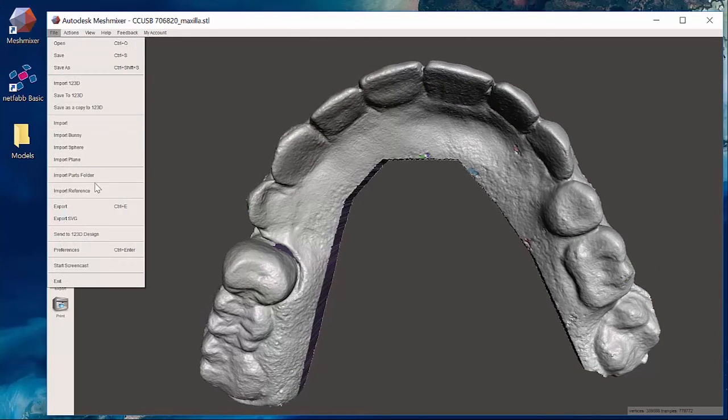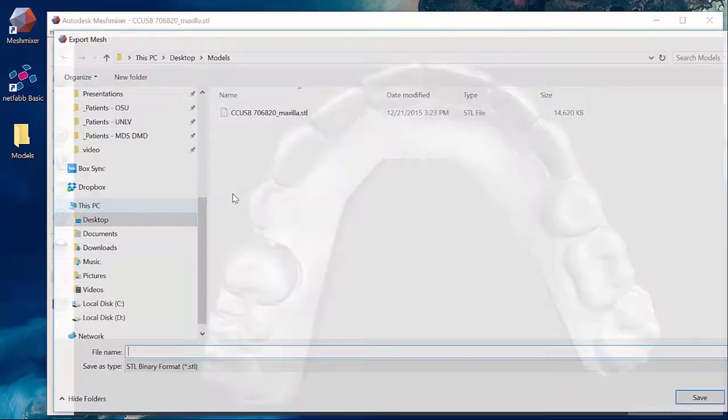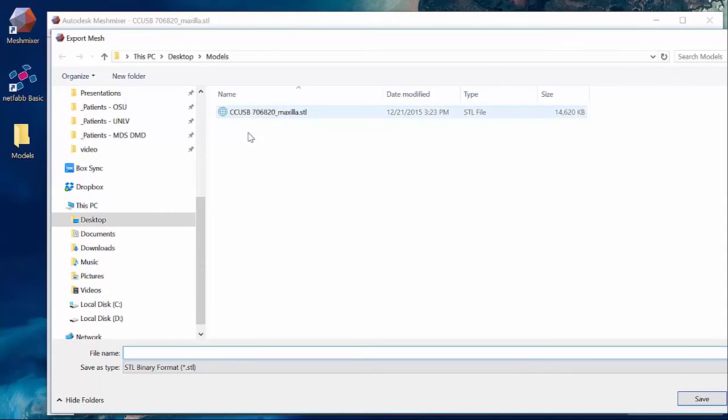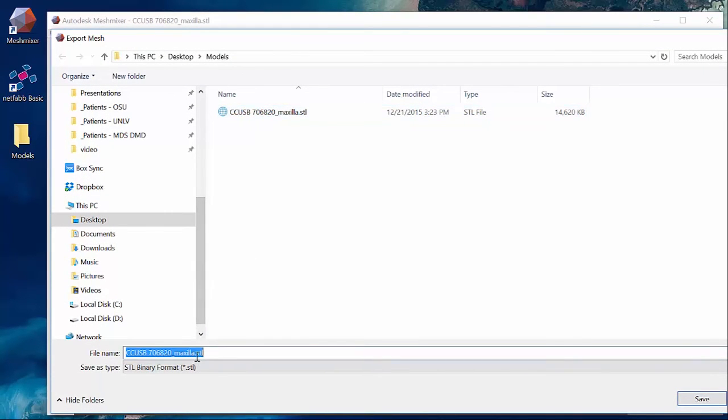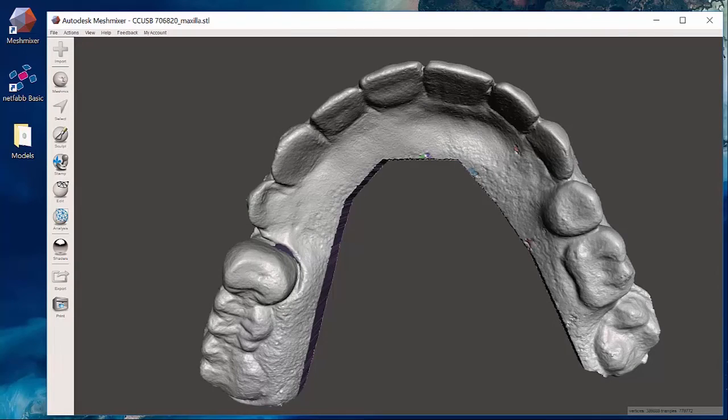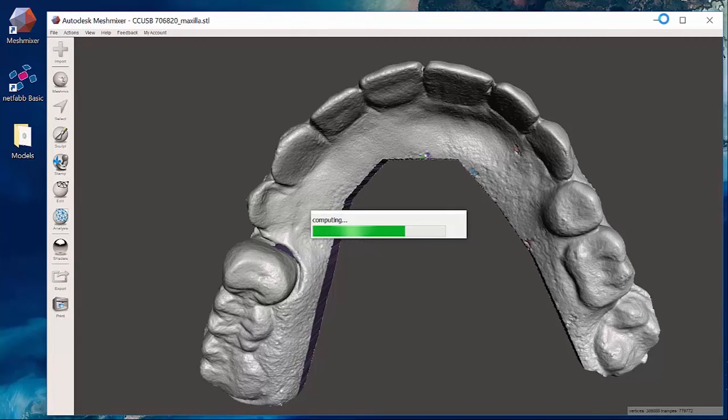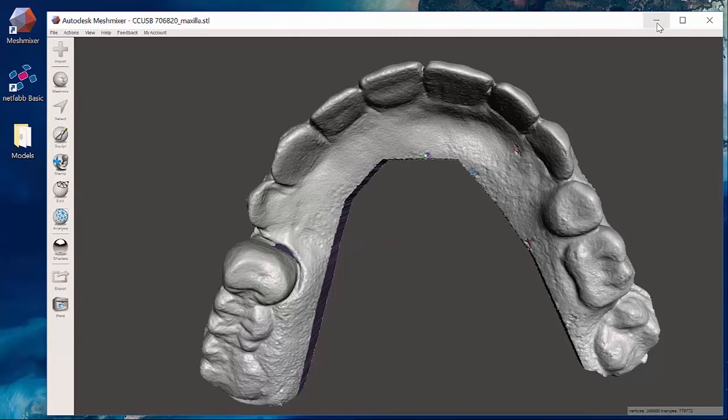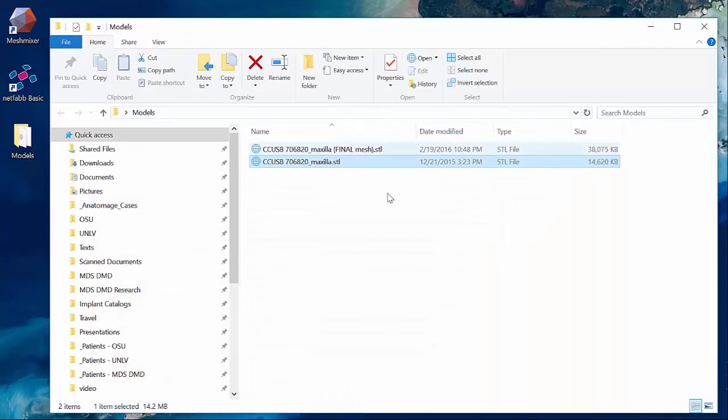Now at this point I can go ahead and hit export, give it my same maxilla name and final or final mesh, and now I can import that into my 3D printer software.